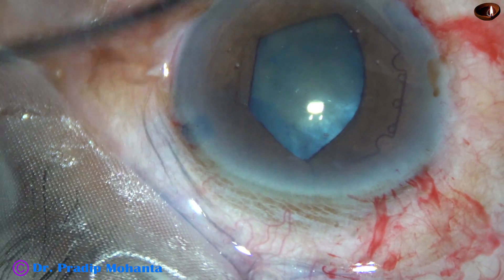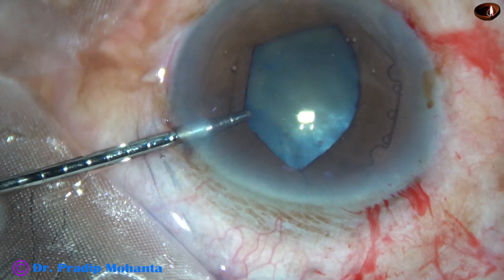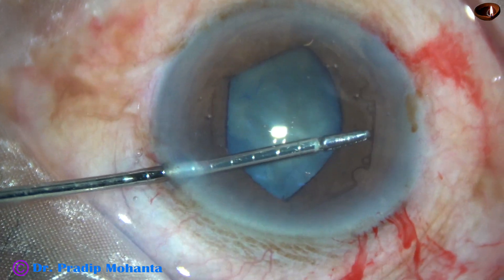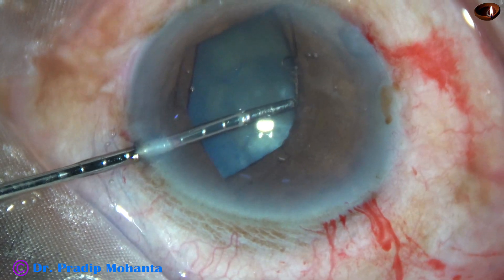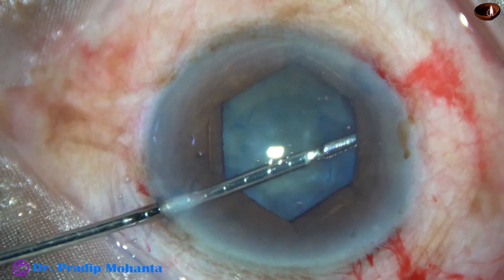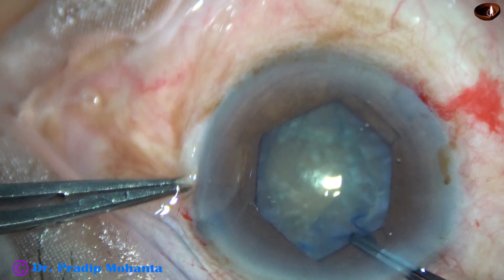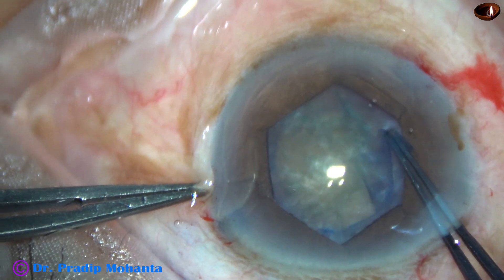The anterior chamber is still deep. The flange at 10 o'clock is then tucked by the non-dominant hand, and it is done. The pupil has taken a hexagonal shape.